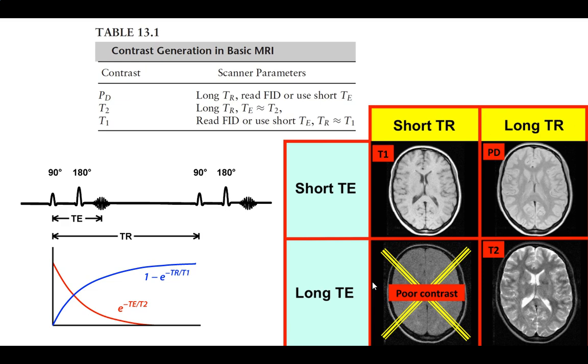With the T1 again, our big concern had to do with TR. We had to make sure we were setting that one for the contrast. So that has to be short. So that has to be really short because TE is always shorter, or almost always. Right? This is the only one that's a little bit odd.